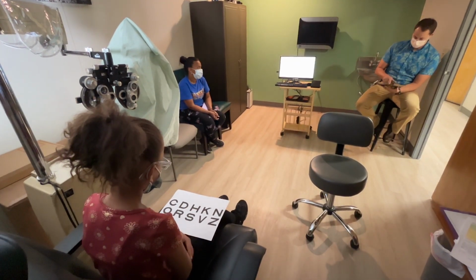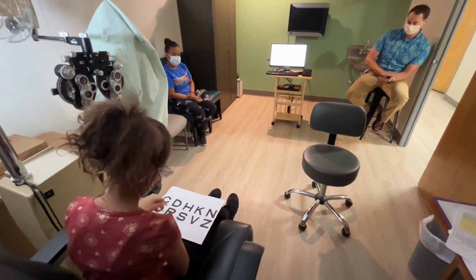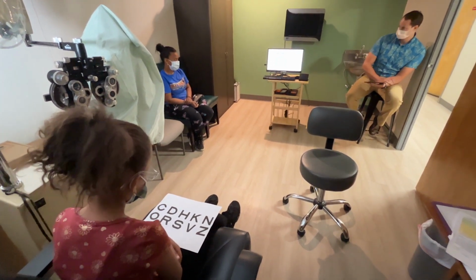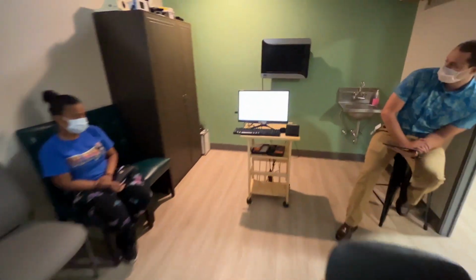A Sloan matching card was used to enhance eETDRS that was performed on the M&S clinical trial suite.